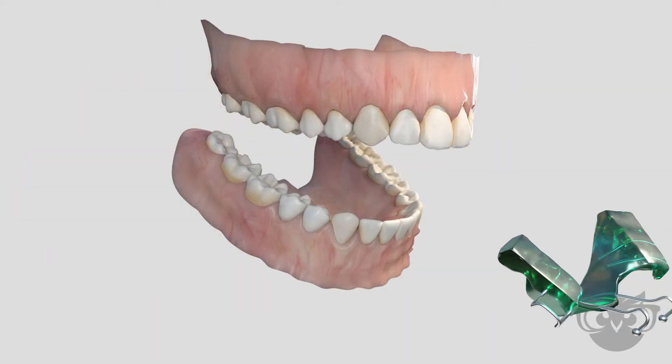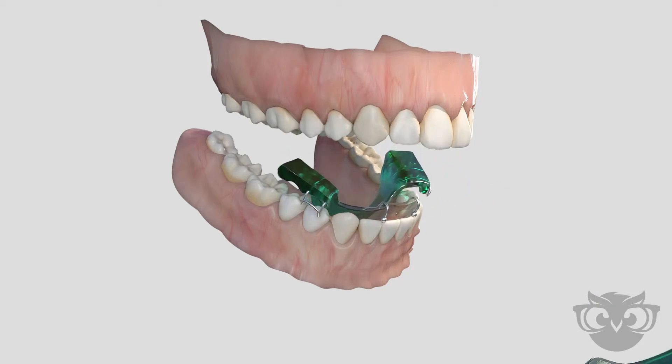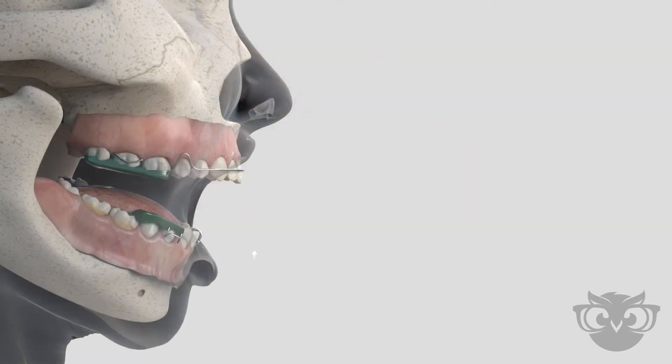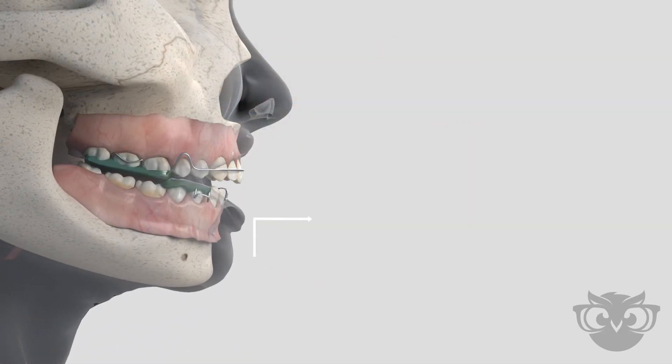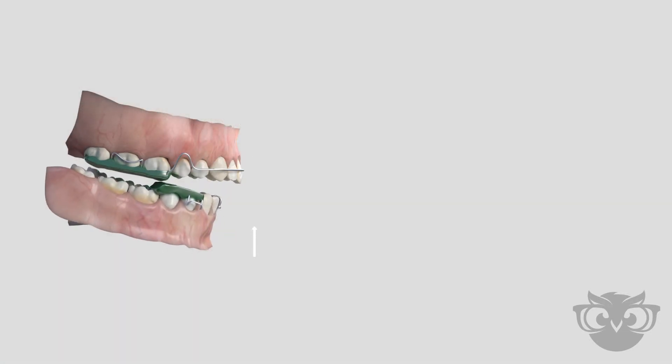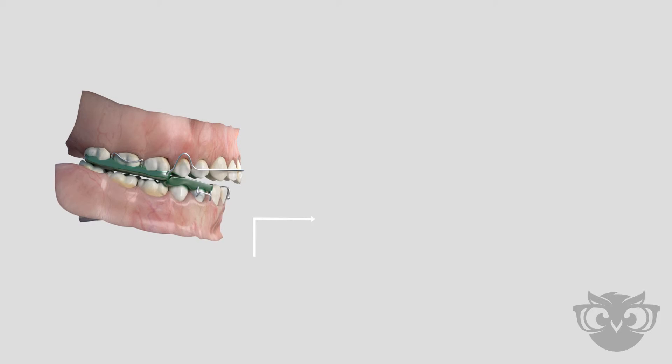The functional appliance is customized, designed to fit the needs of each patient. Once in place, the appliance will guide the lower teeth forward. Over time, this guidance leads to the correction of the bite and jaw relationship, resulting in improved function and overall aesthetics.